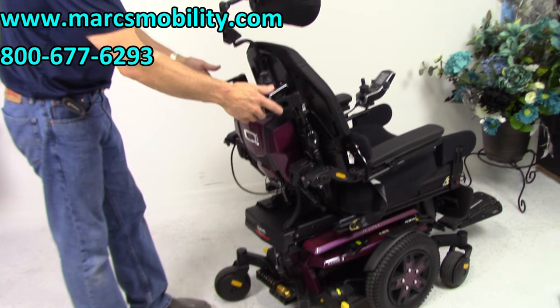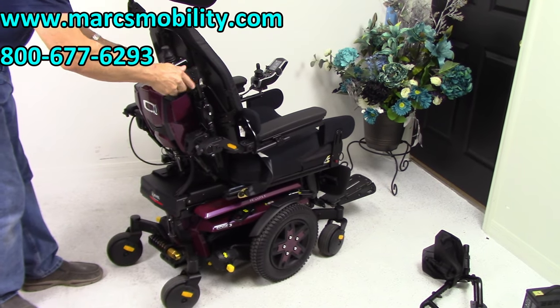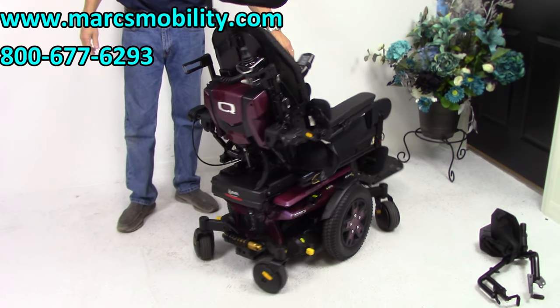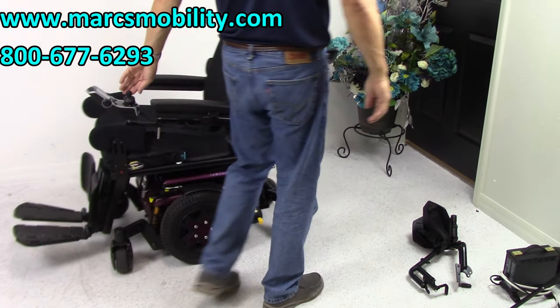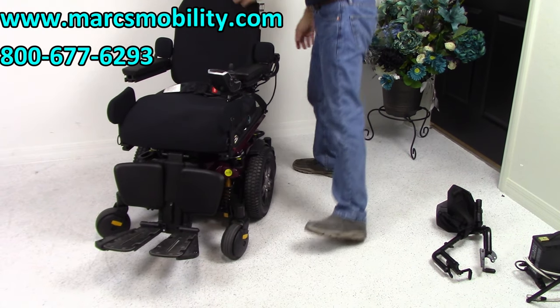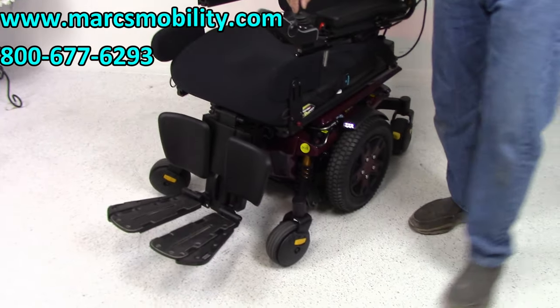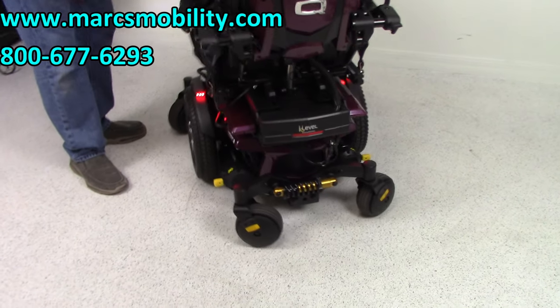Back here we've got bag hooks so if you want to carry a backpack you've got hooks right here — that's custom. Also, this chair is equipped with a light kit. I'm going to turn the lights on — there's a little tab back here. You can see the headlights here and the rear lights in the back of the chair.